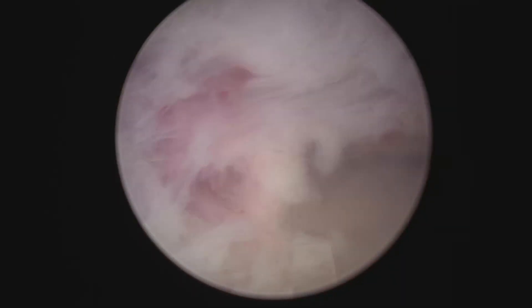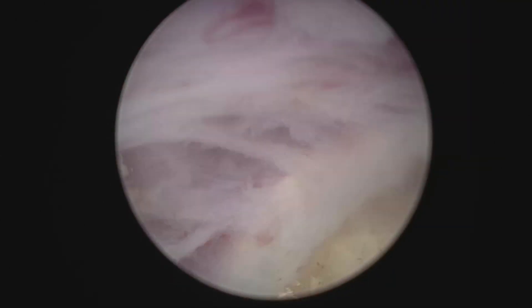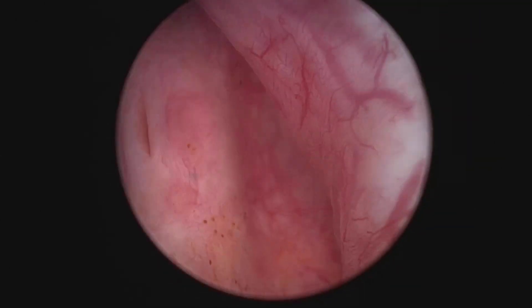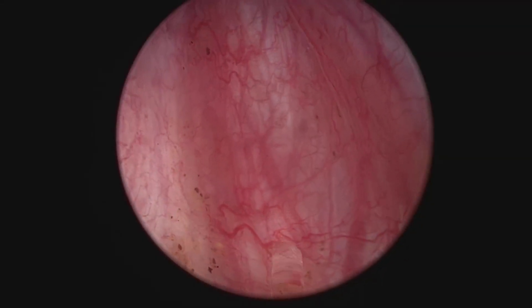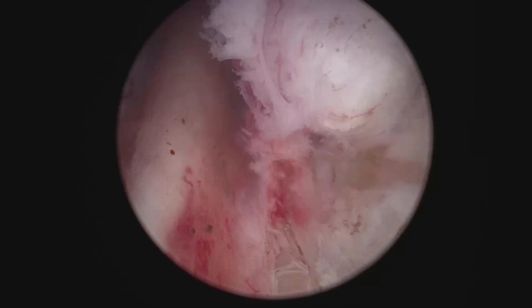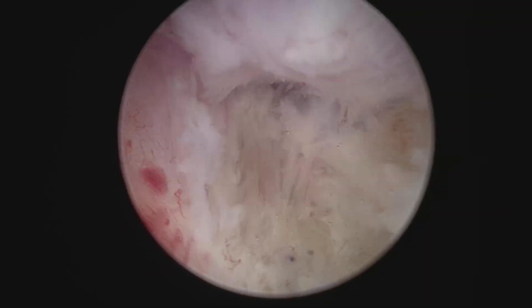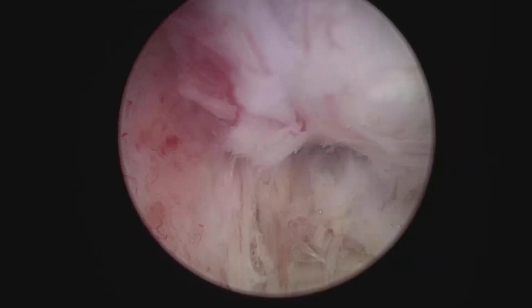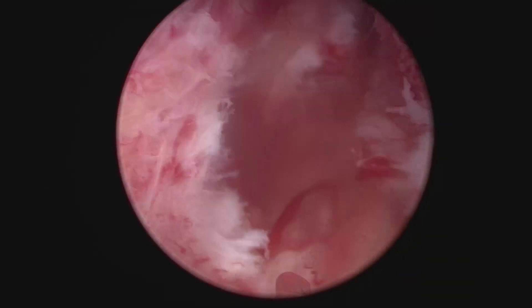I'm using a Holmium 100-watt laser. In this case, I'm not using the new Moses system. The settings are two joules and 50 hertz. It's important to deepen a little bit this white line — you can see the sphincter edge.